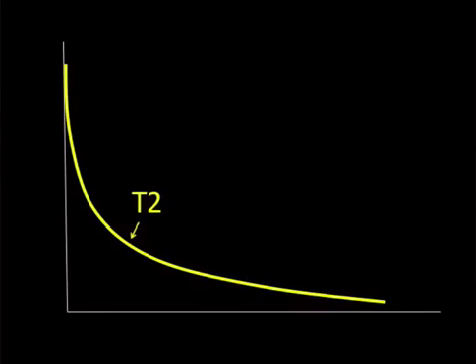Now, the signal of T2 decays faster than people who do complex math to predict these things thought it would. And the reason is that their predictions are based on tissue spin interactions alone. So just that second part. And for this reason, the math falsely assumes that the main external field is absolutely homogeneous. It is not. The field is heterogeneous, and because of this, you've got additional interactions which further speed the decay.